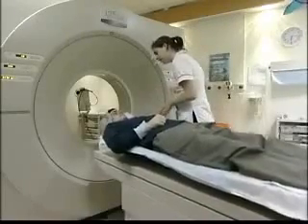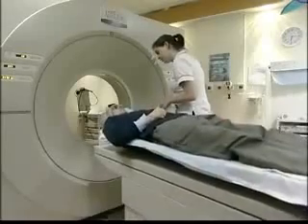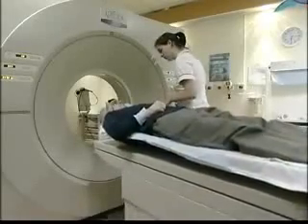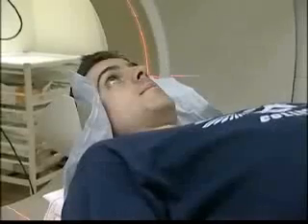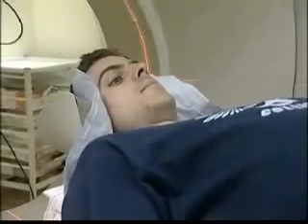An initial x-ray of this patient revealed a fracture. However, the doctor responsible is also worried that there might be damage to the top of the spine, so a CT scan is being performed.